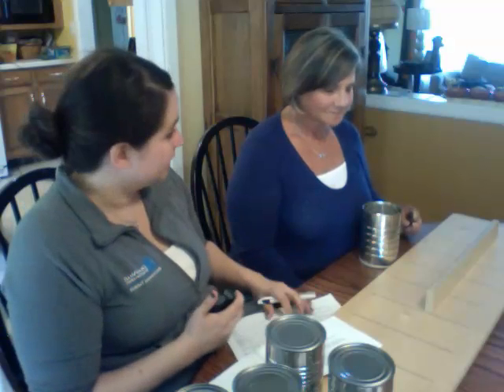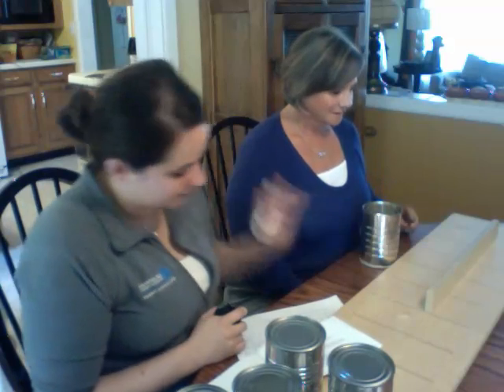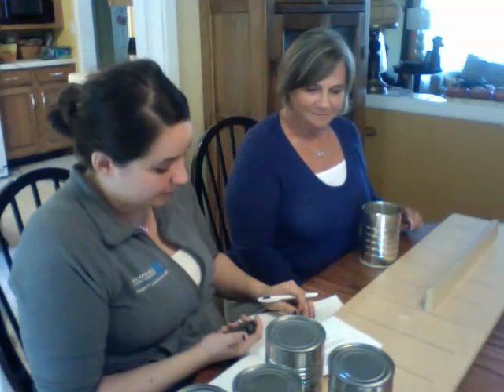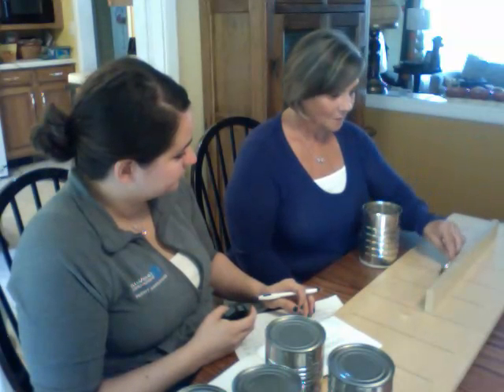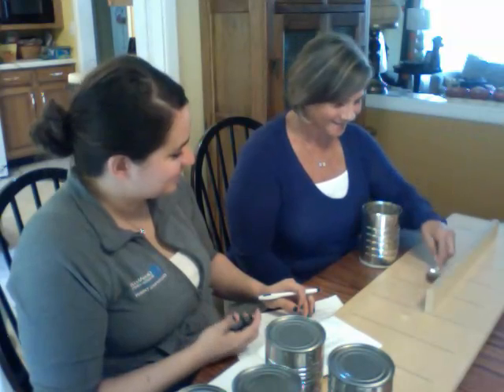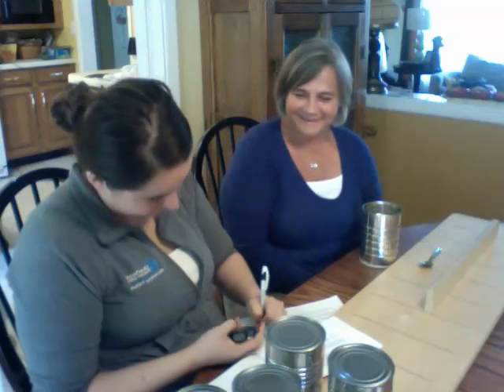All right, are you ready? We're going to do the same thing with your right hand, beginning with that one. All right. Very good. Thank you very much. All right, you ready? Go. That's all right. Very good. All right.